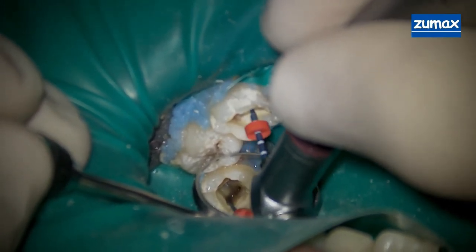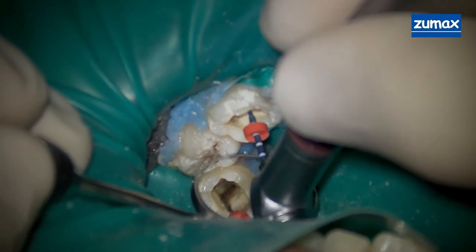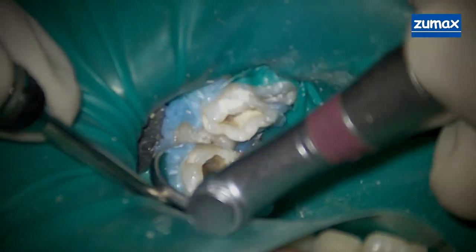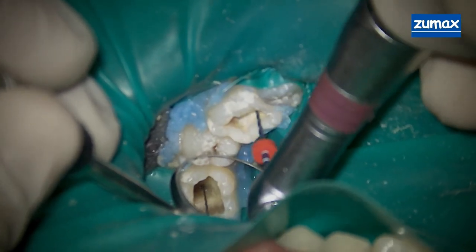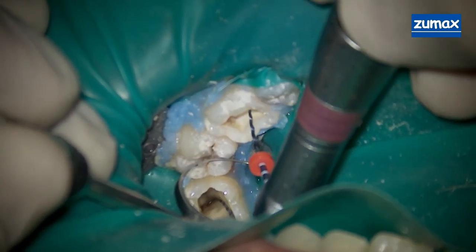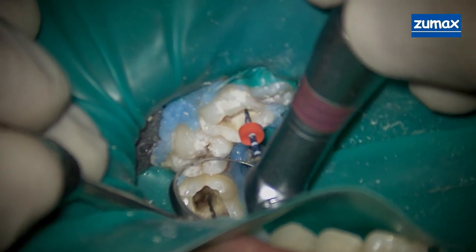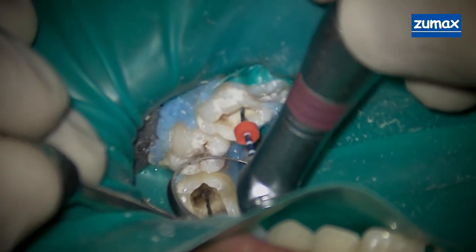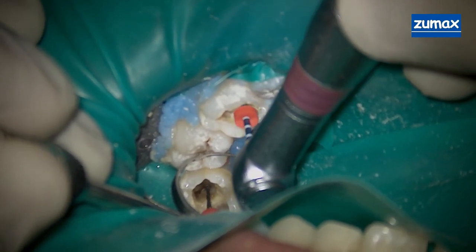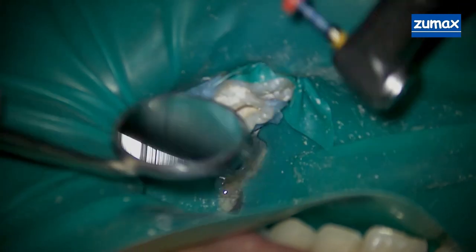After the glide path has been established, you're going to take a radiograph with your size 10 files within the canals to ensure that the working length is correct. What you're seeing me use here are the rotary files. You start off with a size 20 after you've established your glide path, and then slowly work that down to the correct working length, which you set with your marker.